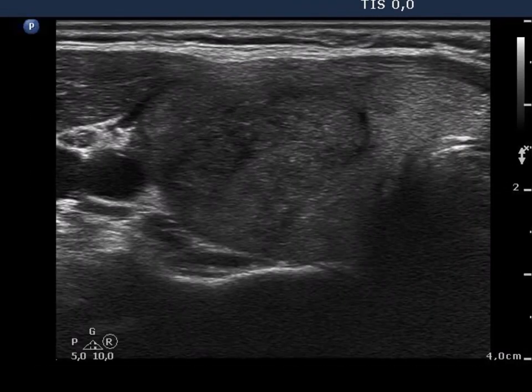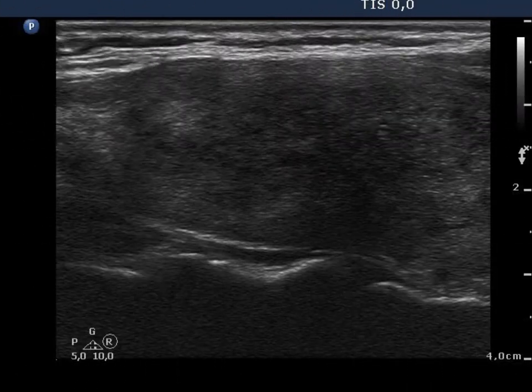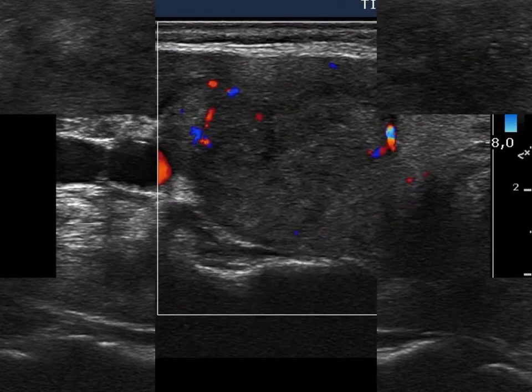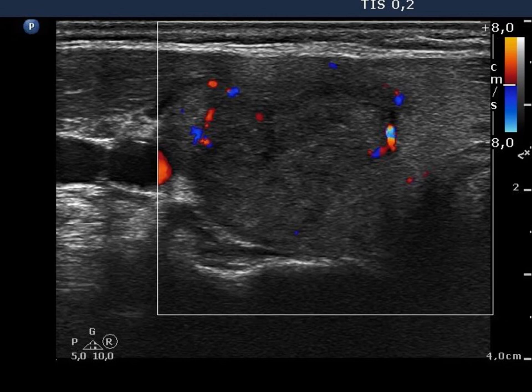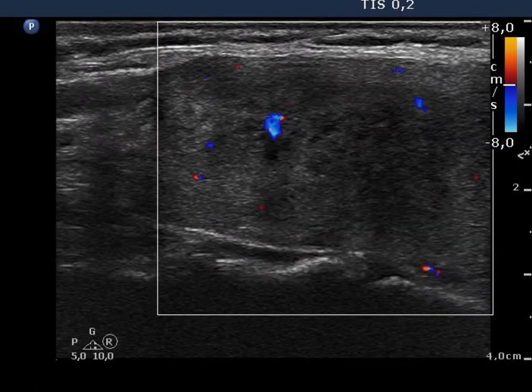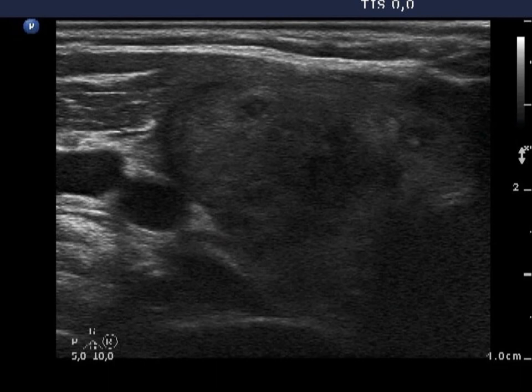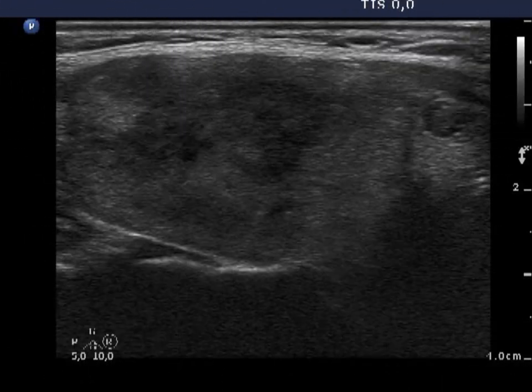First, a typical ultrasound presentation of De Quervain's thyroiditis is demonstrated. The right thyroid is echonormal and composed of hypoechoic, ill-defined areas. The vascularization is decreased. There is a small hypoechoic lesion presenting microcalcification in the lower part of the right lobe, which will be pointed with a red arrow in the video.